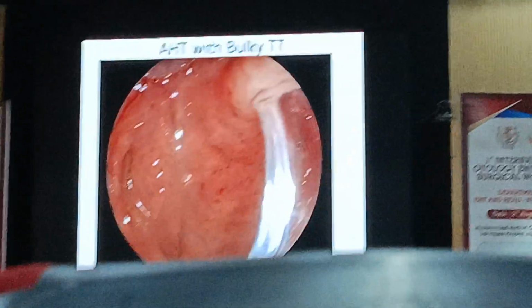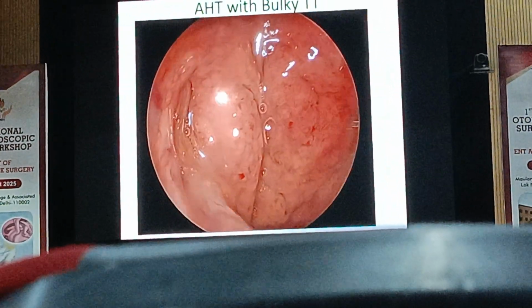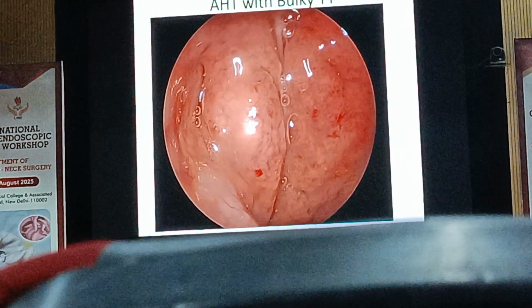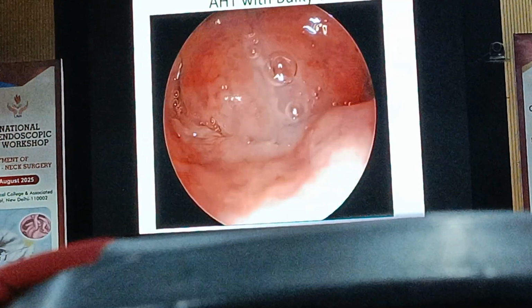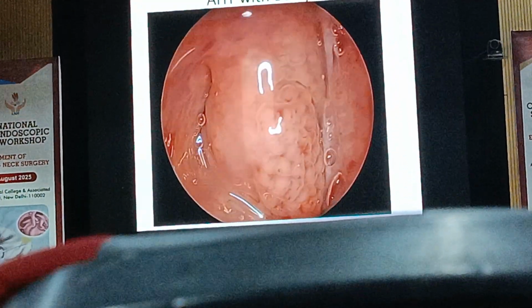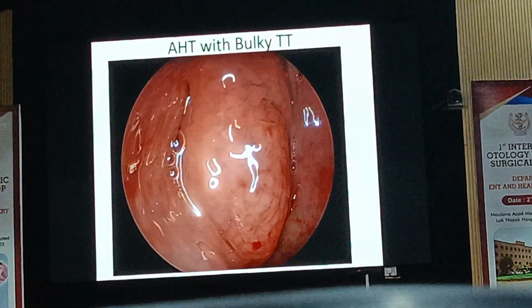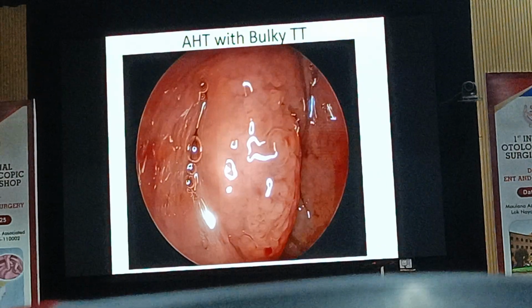Okay. See this? There's a huge adenoid tissue, and there's a curve, and you see the torus moving forwards. So there's a paradoxical movement of the torus. Actually, it's not moving medially; it's coming forward. So hardly any opening is occurring there. Once the patient swallows, nothing happens, and you see a lot of cobblestoning of the walls of the torus. And there's quite an edema in the lateral wall going inside in the valve area. So this is an ideal patient who will probably require a tuboplasty.